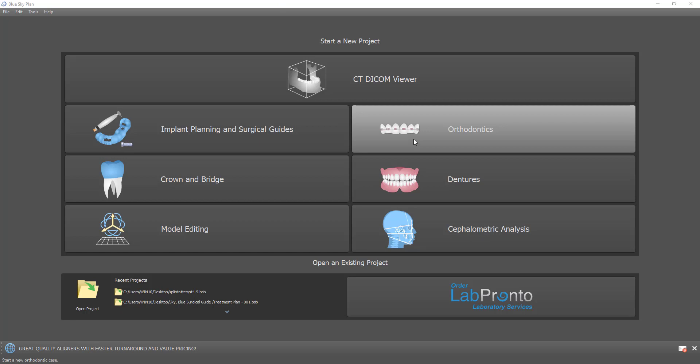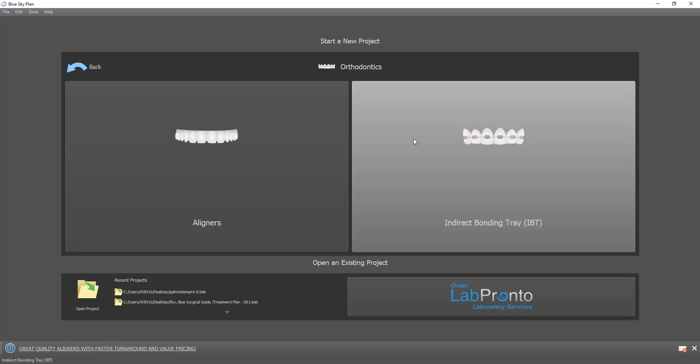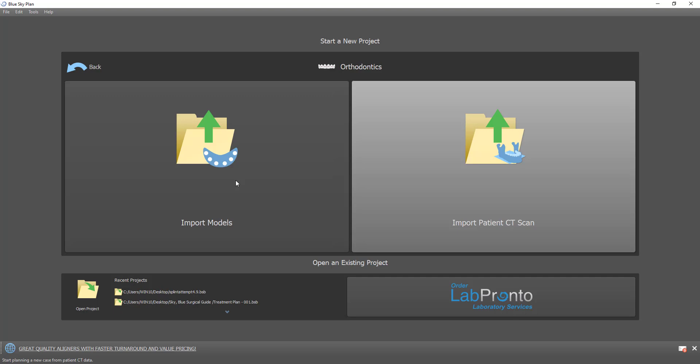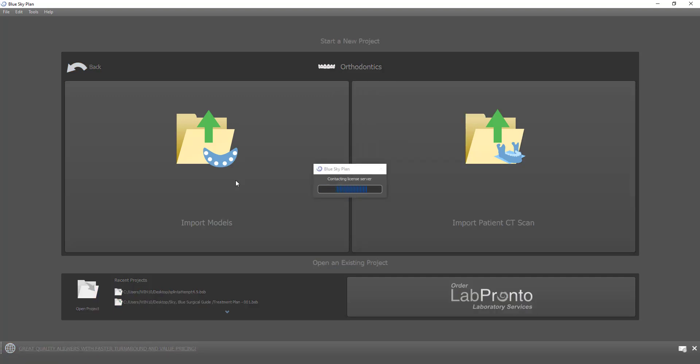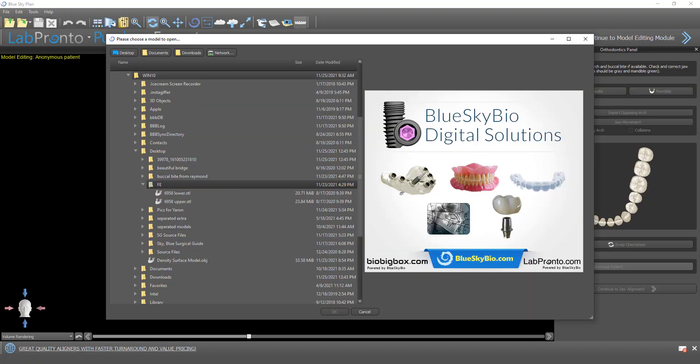I'll demonstrate the process with orthodontics as I think that's probably where it has the most important significance, and then I'll show another module as well. I'll run through the process very quickly, not to teach it, just to demonstrate how we get to the video export stage.